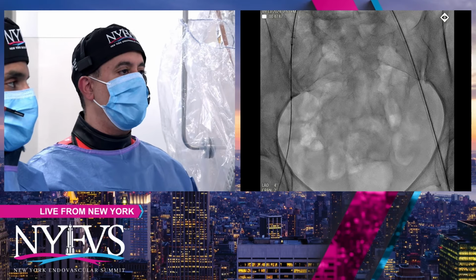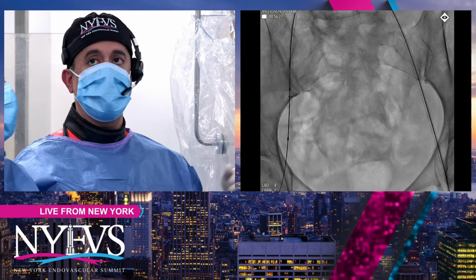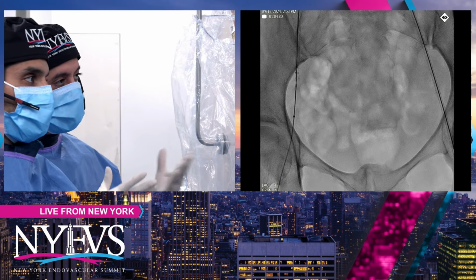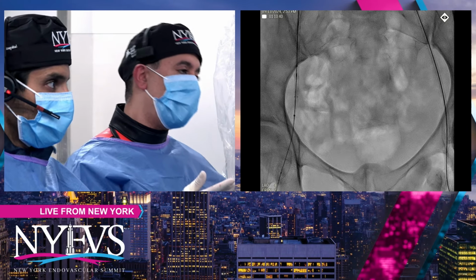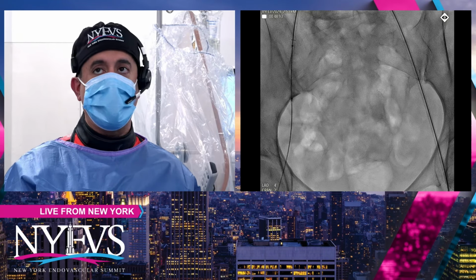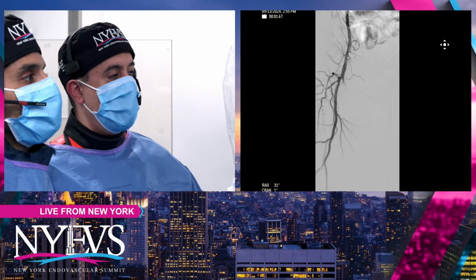But we had a little bit of difficulty because of the sheath and the angulation and that lesion as well. So here we did the balloon sheath technique where we took a 6.0 balloon and tracked our sheath over the balloon inflation, and as the balloon deflated, we tracked it over for a smoother transition so that there was no disruption or change in the architecture of the iliac stents. We had an 8-French sheath because we're thinking of ISR and probably doing Rotarex, which Dan Hahn had talked about earlier, and the people on the panel in the session here talking about different modalities of how to treat ISR. Our goal was to use Rotarex in this case, and that's why we decided on an 8-French system. So we did have a little bit of challenge, but eventually everything was placed.